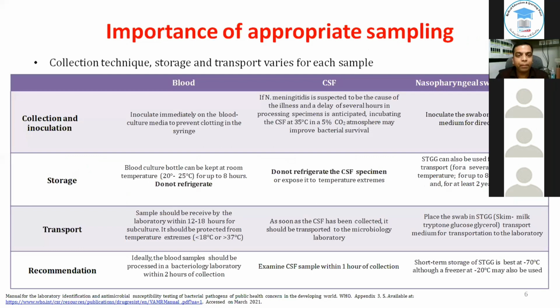To quote an example, let us see blood culture. It is observed that most of the times a single blood culture bottle is collected, say an aerobic bottle, but as per recommendations, paired bottles should be collected from both the hands: from the left hand aerobic and anaerobic from one prick, and from the right hand aerobic and anaerobic from another prick. Why the necessity to have paired bottles?